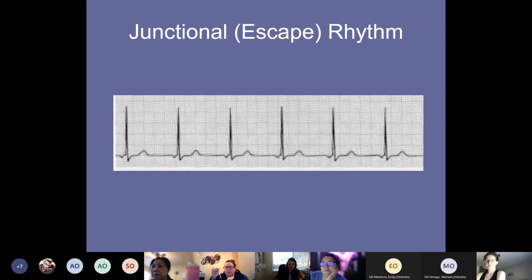Almost. Yes, if it was the AV, Melissa, your rate would be between 40 and 60. Okay, so that's where I'm kind of confused because I have the notes from the original lecture and I wrote 40 to 60 beats per minute on this slide. So it can be, or it can be accelerated junctional as well. We didn't really specify in between, but because it's so close to the AV node, it's going to be around that rate.